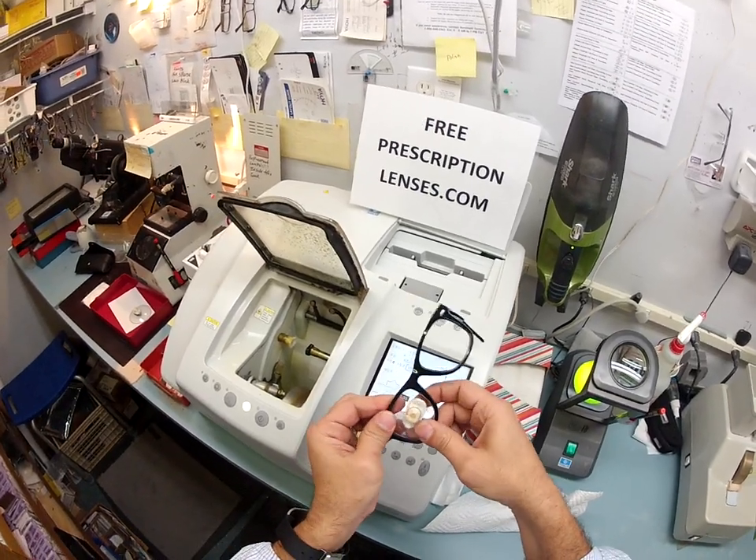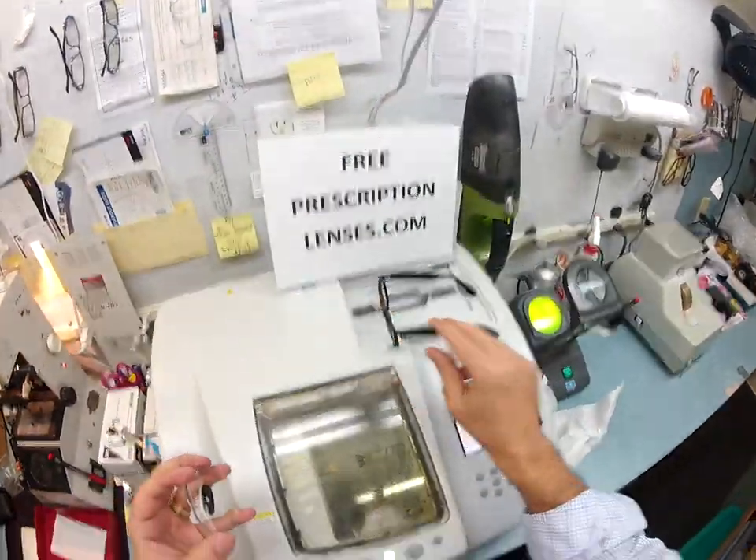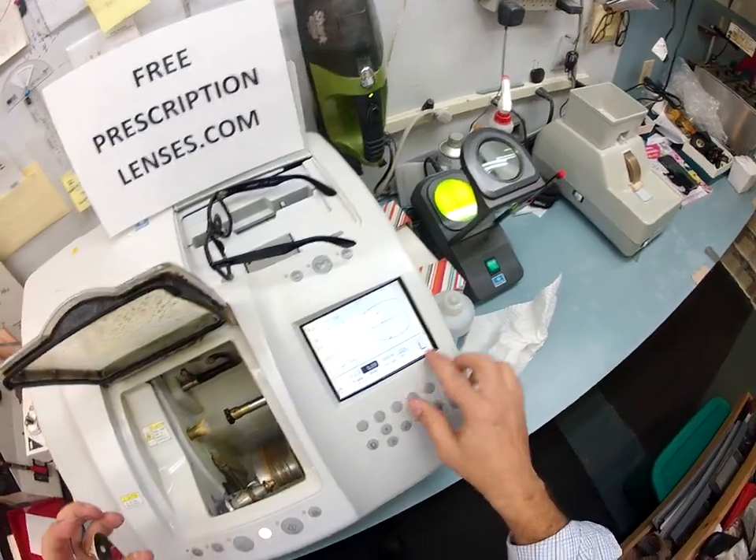In order to test to see if the lens is the correct size, I tuck it in at the outside corner and using my thumbs I push down at the edges — and it snaps in perfectly. So I am going to cut the left lens now.